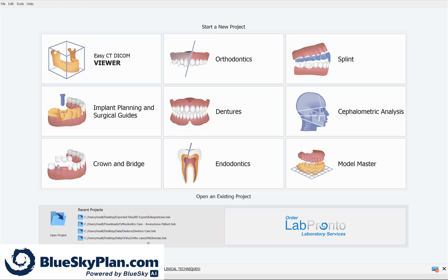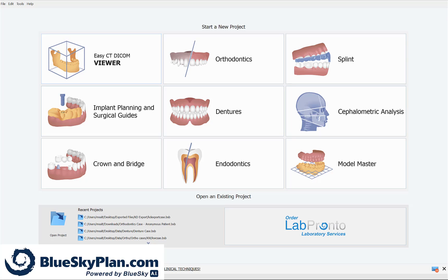I'll now take you through the step-by-step process flow in the Blue Sky Plan software, demonstrating each stage of the process. This is really the easiest and most straightforward way to get started with digital implant planning, as at every step you're prompted exactly what to do next and most of the process is powered by artificial intelligence and is automated.